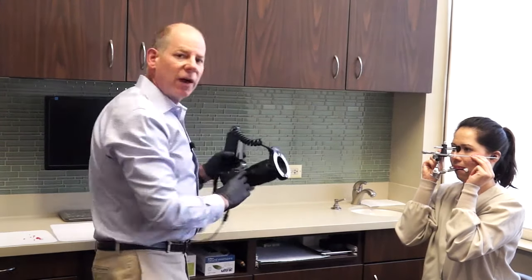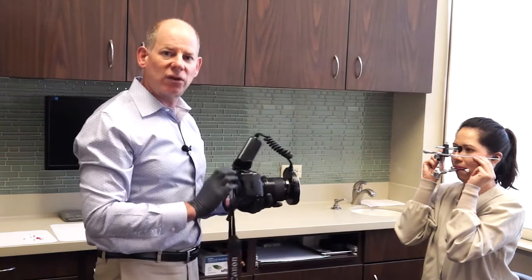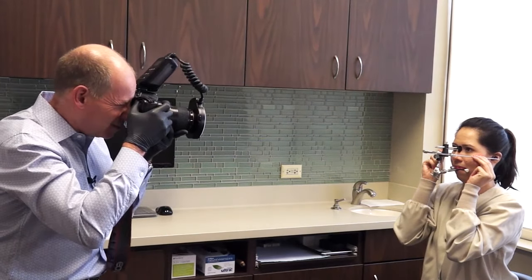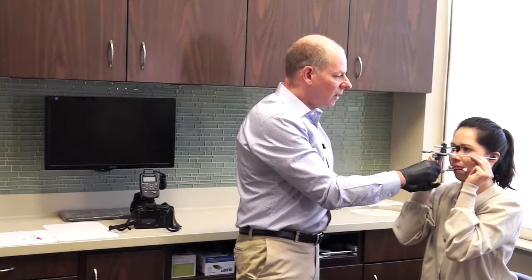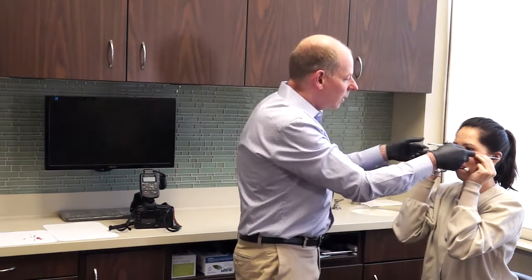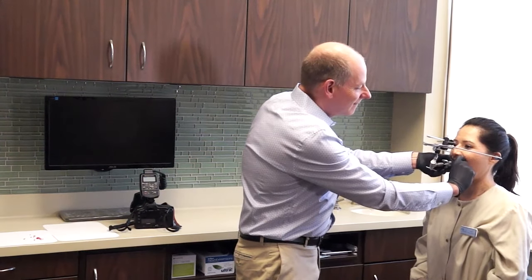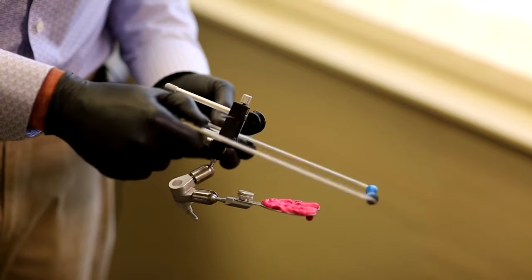Before finishing, I take a photograph with my 35mm camera of the ear bow in place. This way, when mounting the case on the articulator in the lab, if there's a cant to the model I can go back to the photograph and determine if I took a bad face bow or missed something. Once the image looks good, I make sure everything is nice and tight, then release each of the mechanisms. I have Erica open, remove the cotton rolls, and pop the plate off from the side — and that is how we get a nice, predictable ear bow that we can transfer to the articulator.